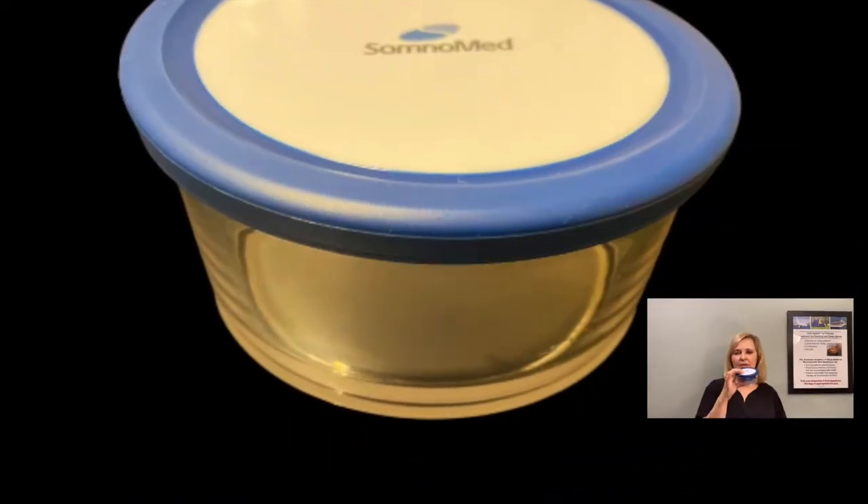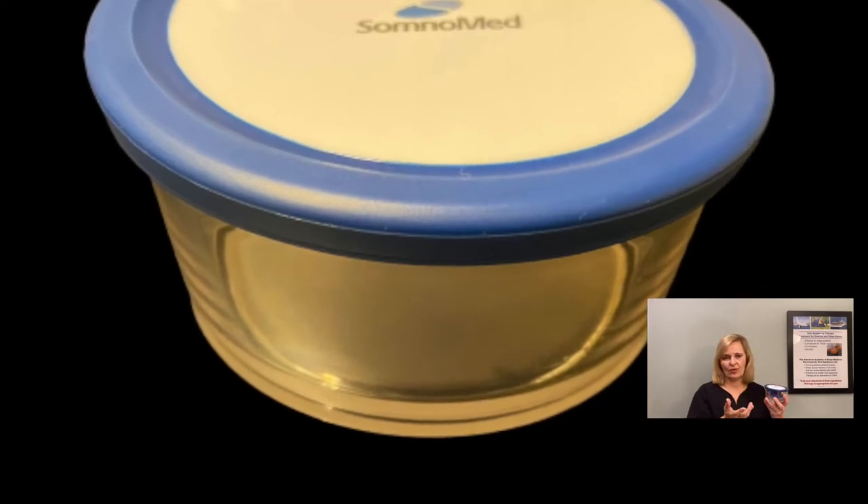Also, if you have a Somnodent device, it would come in something of this size. I've provided the replacement link to that one. It's a clear container — you can soak things in it and store it. This is the Somnodent case and you can see the link for that as well.